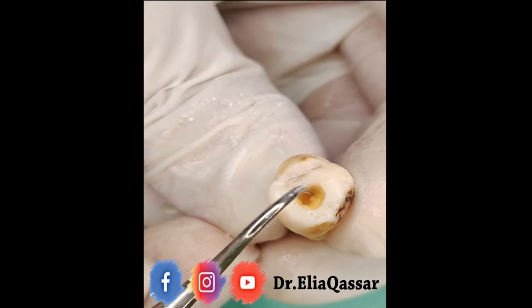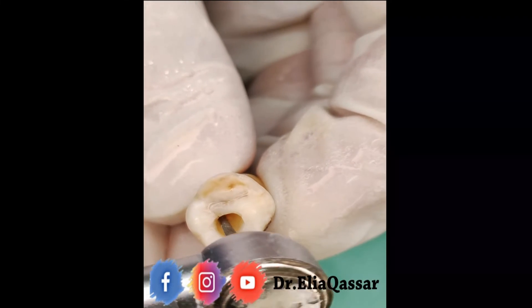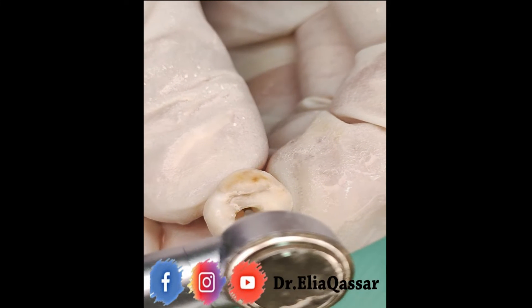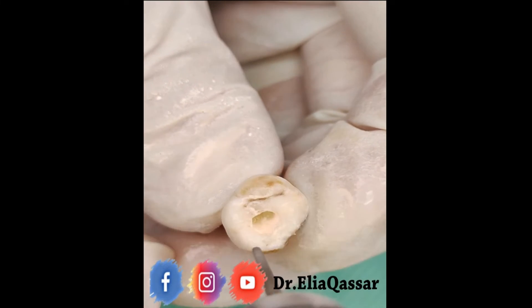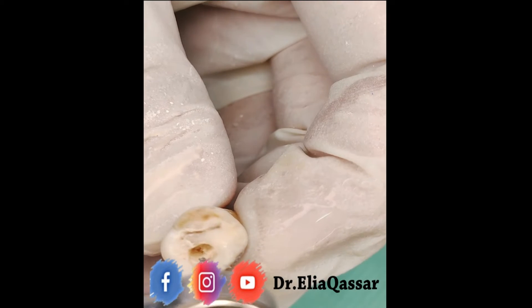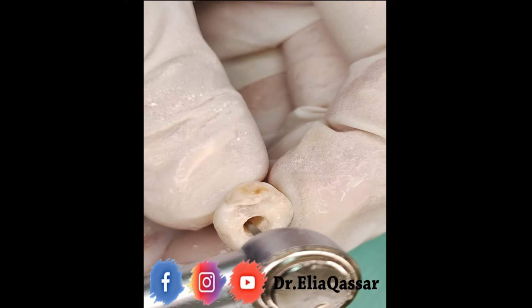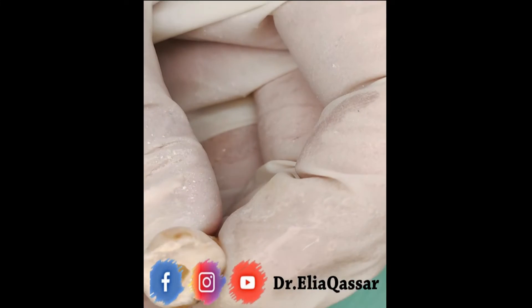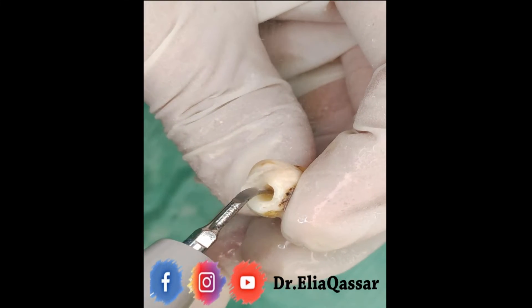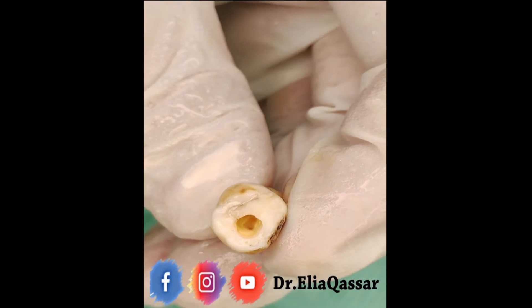As you see here, I almost penetrated into the pulp chamber — there's a small hole, which means I penetrated into the pulp chamber. I use the scaler again to make the access more visible, and after that you can continue.